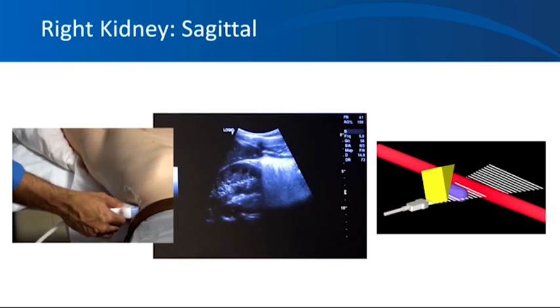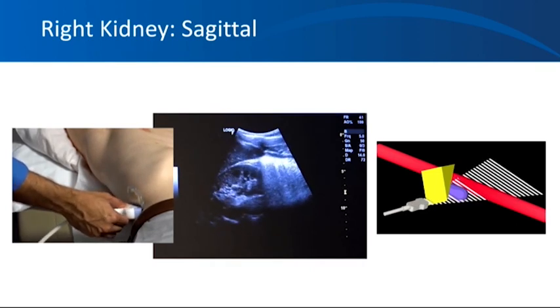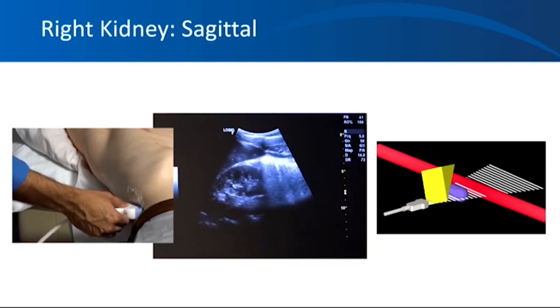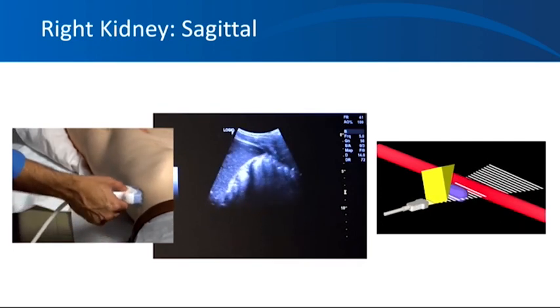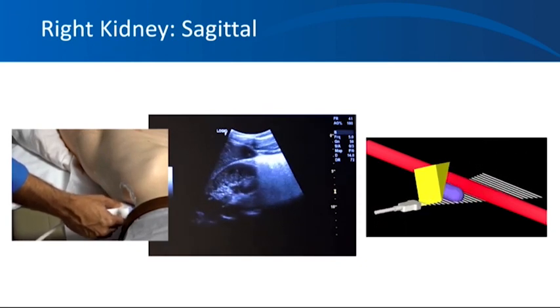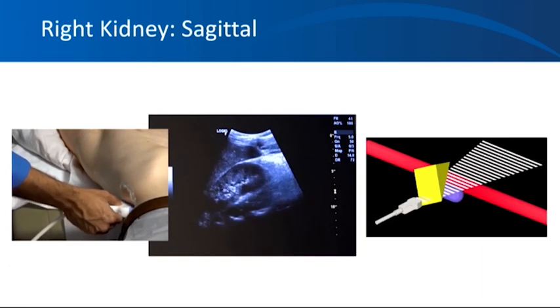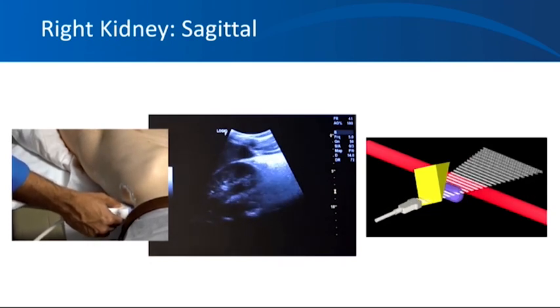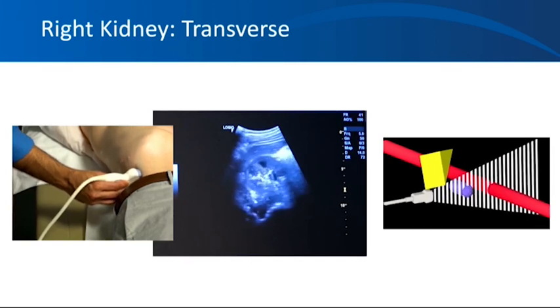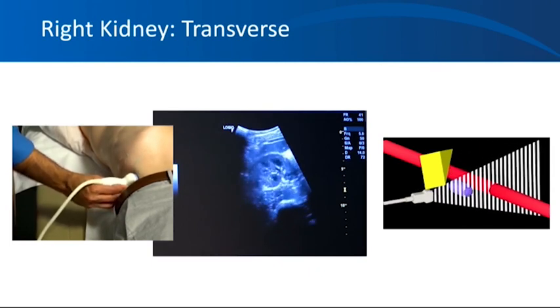Note that kidneys are obliquely positioned in the body, so imaging planes are not truly longitudinal or transverse in relation to the body — we are talking about the longitudinal and transverse axis of the kidney. Kidneys lie in pretty much the same plane as the ribs. Once you are able to get the entire kidney into view, sweep the probe side to side so all sections of the kidney come into the field, so we don't miss smaller lesions such as small cysts or stones. Once you find a good longitudinal view, turn the probe 90 degrees counterclockwise to find the transverse view.